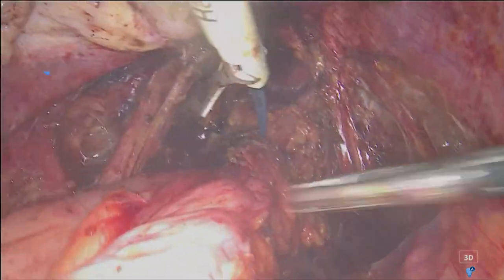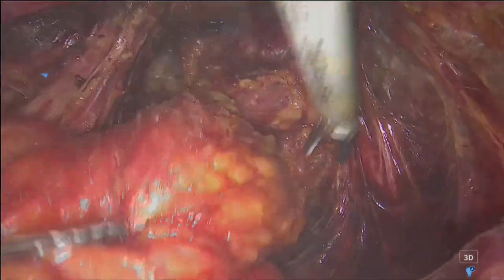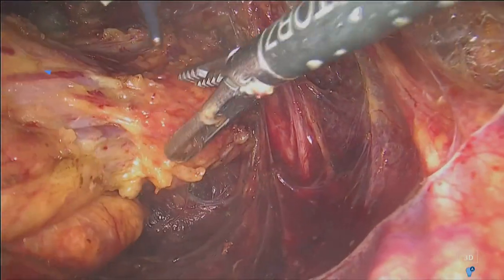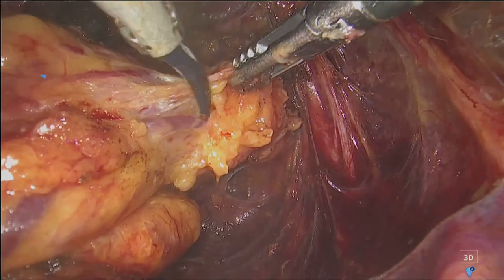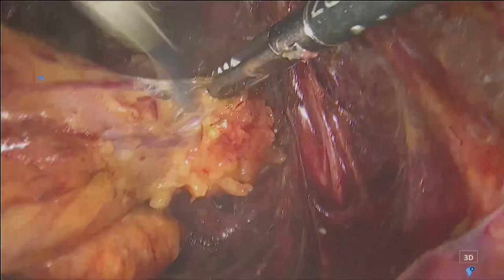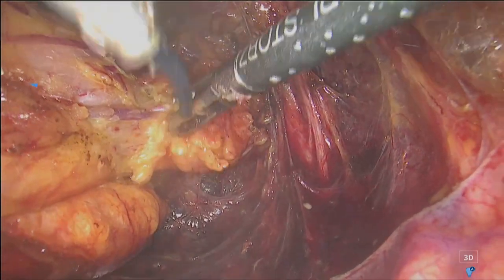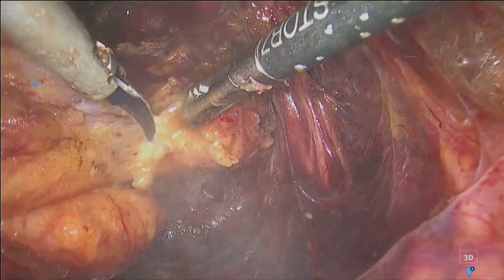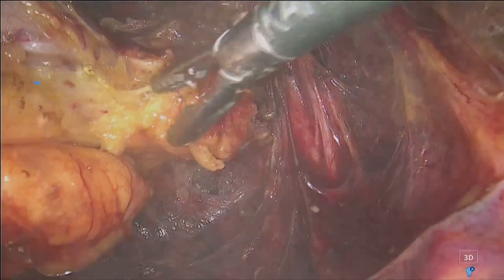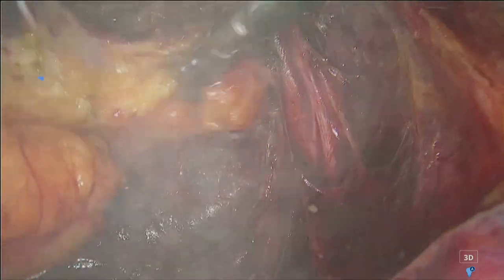small suprapubic mini laparotomy, and we moved to a technique of total laparoscopic resection with the NOSE technique, using the rectum to remove the resected part of the rectum and to introduce the anvil of the circular stapler. So the so-called NOSE that we modified 2 years ago, and we published our technique 1.5 years ago.